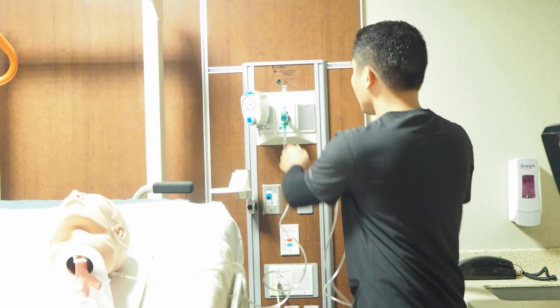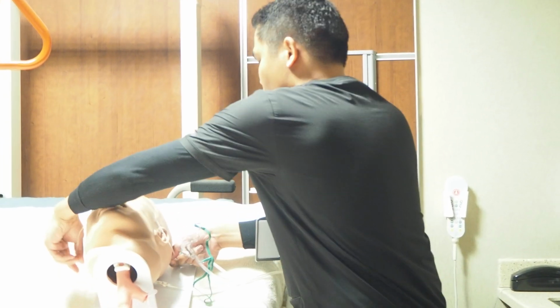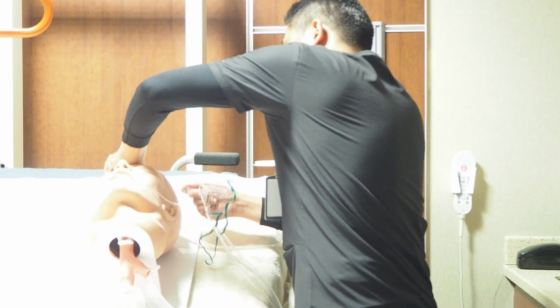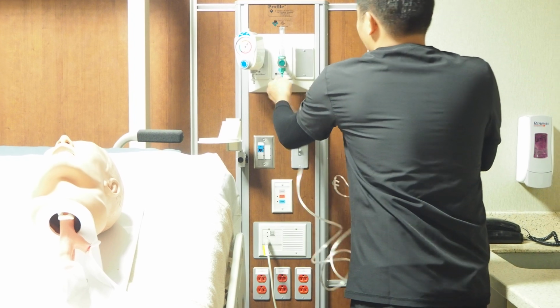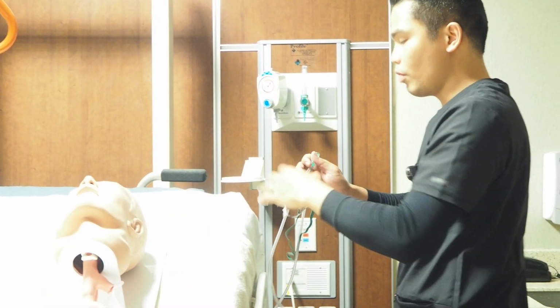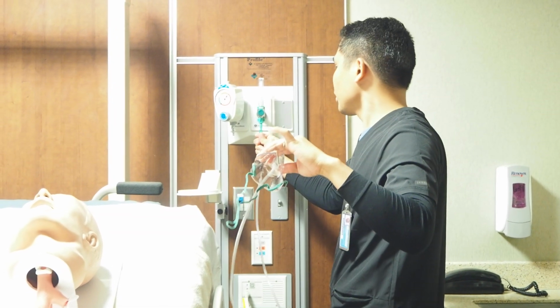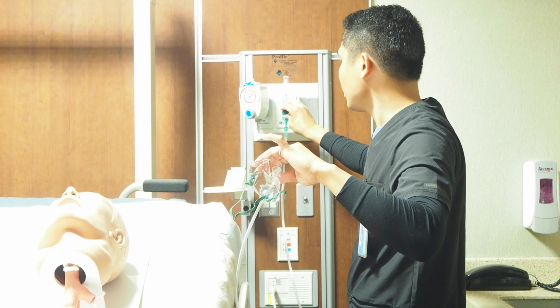So I'm going to turn off the device. And with a simple mask, I recommended a flow of 6 liters per minute. In that way, the patient would receive higher oxygen.